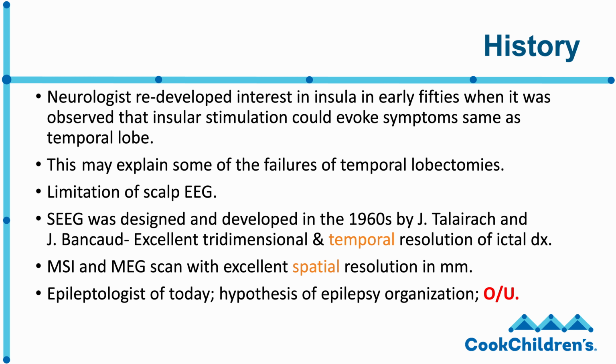And for that, your hypothesis is very important, that you come up with a really good hypothesis of where your seizure is coming from. Because though there is an excellent temporal and spatial resolution, at the same time, stereo EEG has a limitation that it has a very telescopic view. If you are not at the right place, you are going to miss it big. On the other hand, it's an invasive procedure. You overdo it, you are going to hurt the patient.